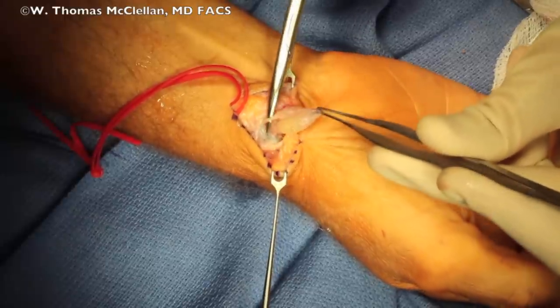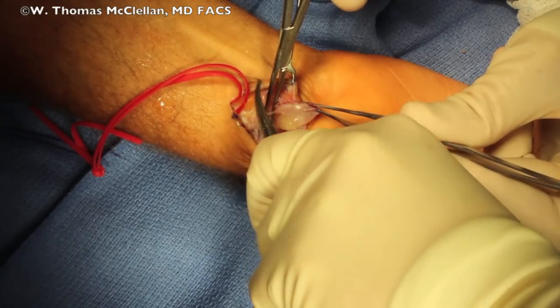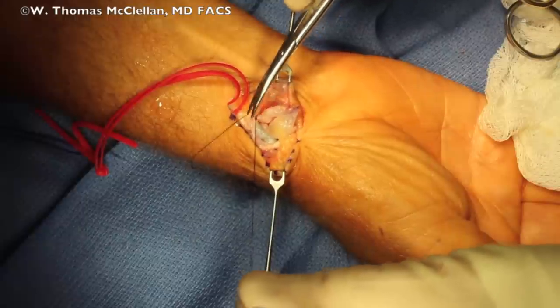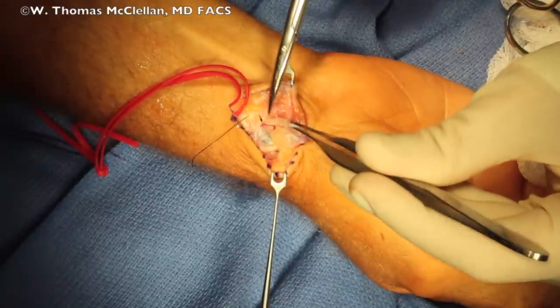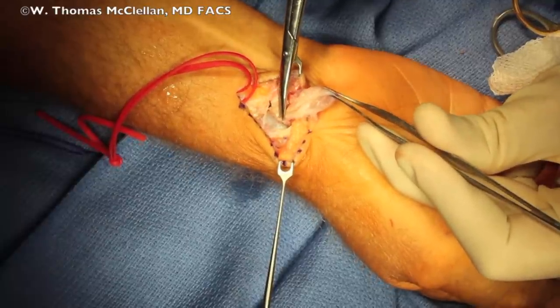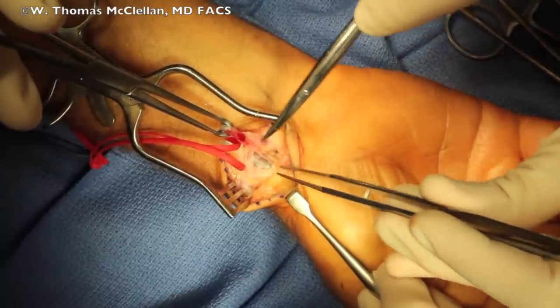Here you can see a small branch coming off of the radial artery proximally. I identify that, go behind it with a right angle, and tie it with a small silk suture. I'll transect that small branch and then look for the contiguous branch distally. It's common for small branches to go over, around, or be intimate with the ganglion cyst. Here's the continuation of that small vessel distally, and I'll use electrocautery to deal with the distal branch.